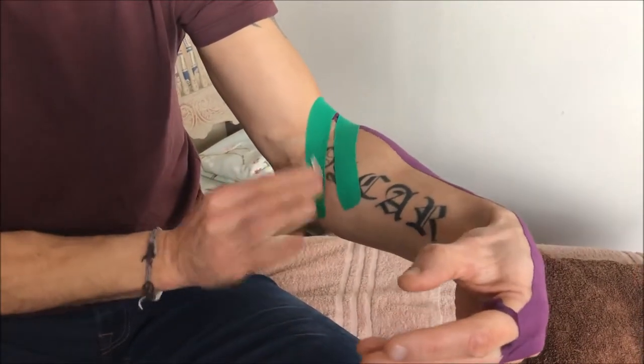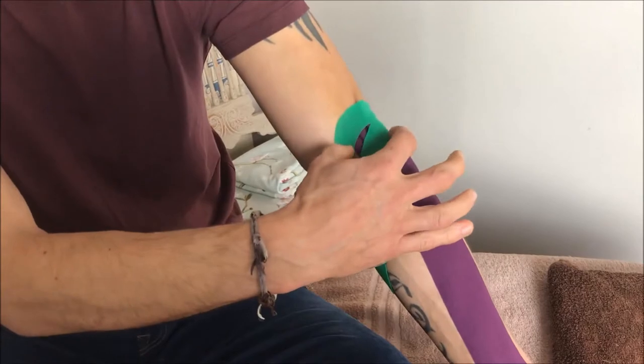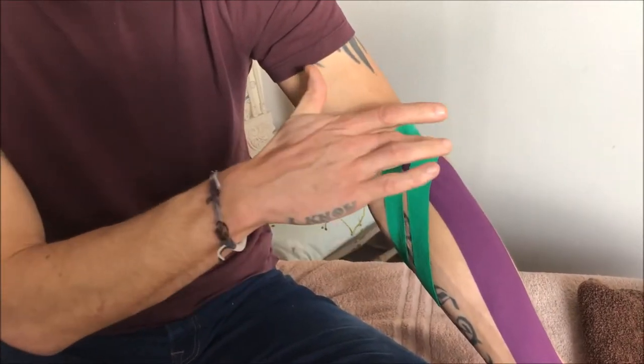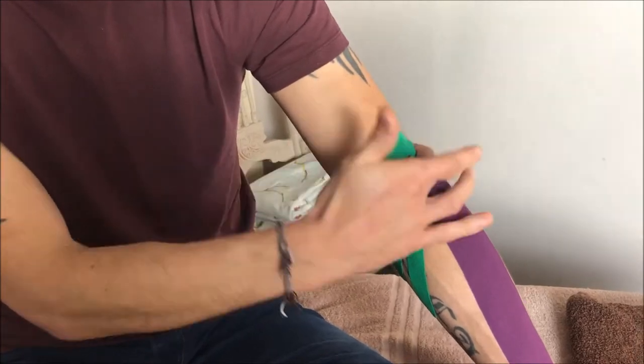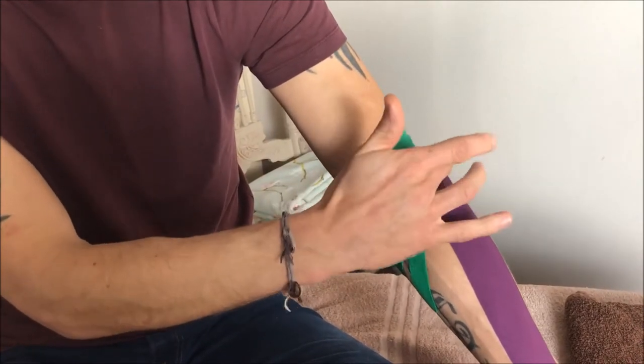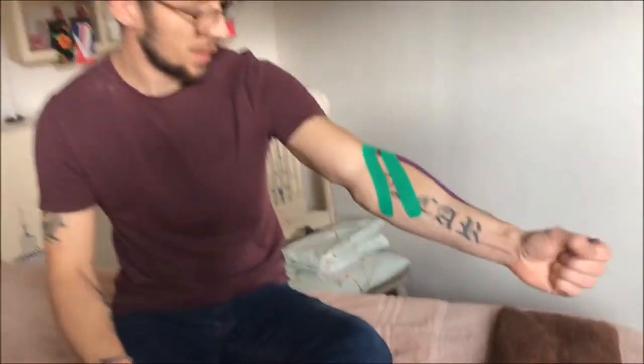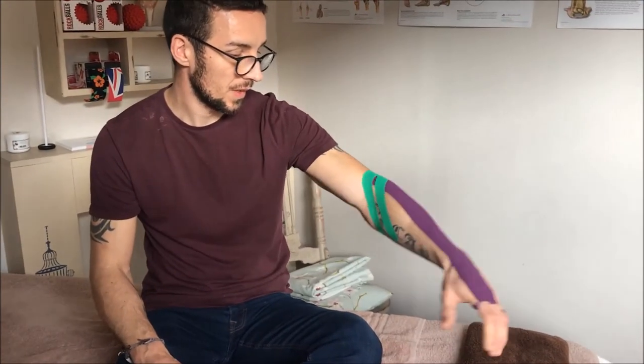This is the effect we want to achieve — we're lifting that tendon and stopping the friction against the bony prominence, the lateral epicondyle. And that's your taping for tennis elbow.